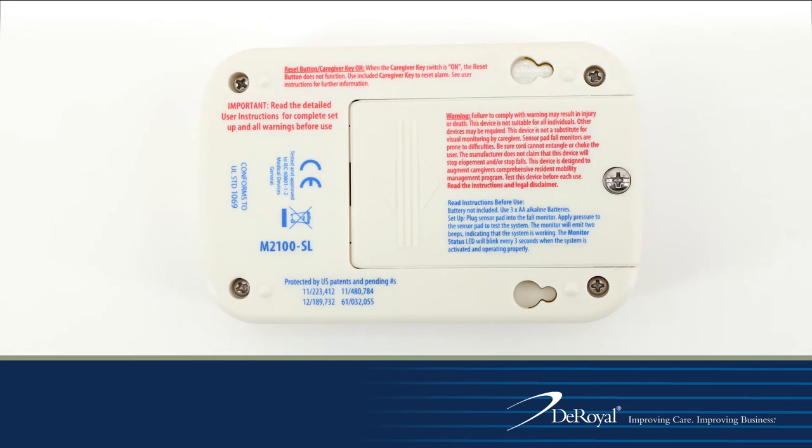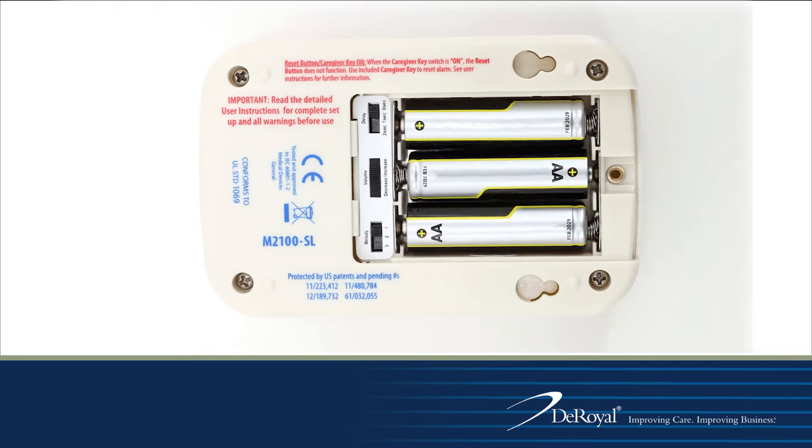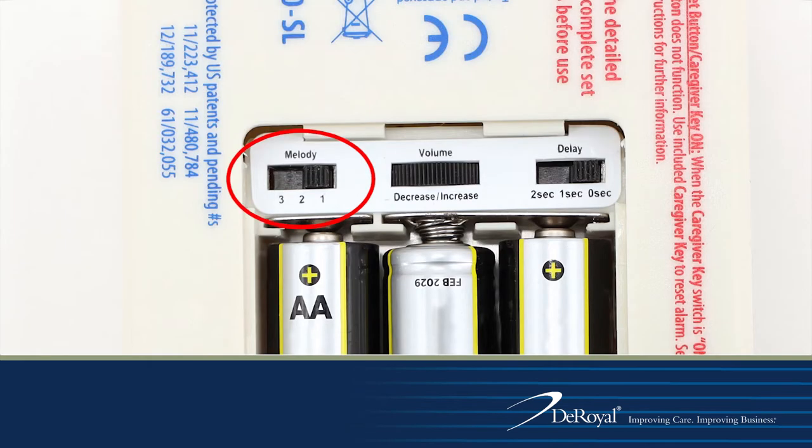On the back of the monitor, slide the compartment up and out to reveal the interior. Inside you will find the battery compartment housing three AA batteries. There are three alarm tone options to choose from, a full range volume adjustment, and three delay options.